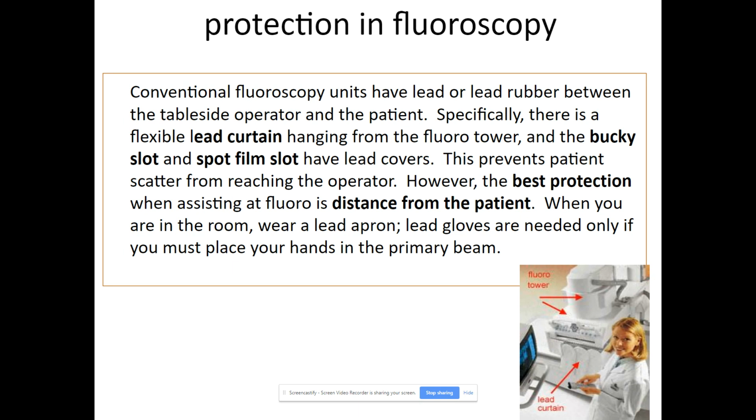And like we said, there's a lot of radiation, not just to the patient, but to who is in there, which is why I do this lab once a year and throw on my apron and fluoro, because I don't want to be doing this all the time. So you have to have lead gloves if you're going to move the patient around, and to actually go beyond that, a curtain of lead, to maybe take someone's hip or thigh and move them into a certain obliquity perhaps.